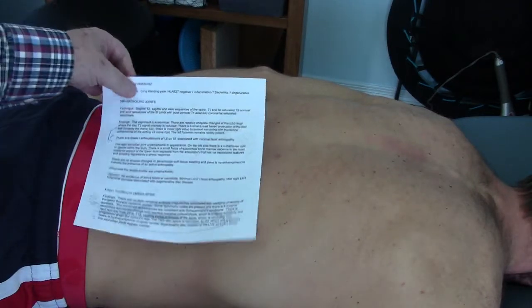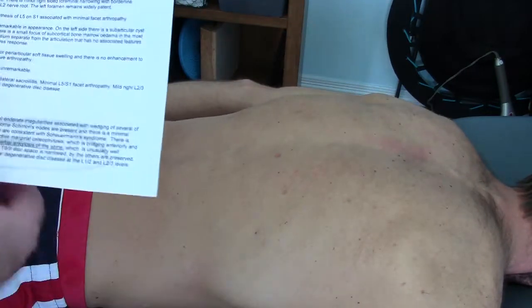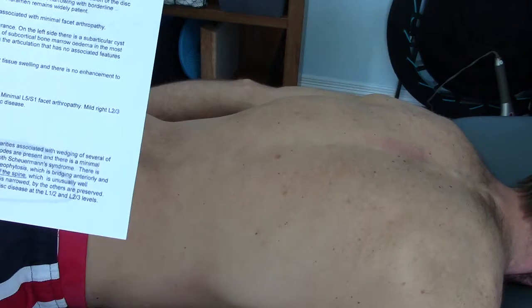This is Dr. Jerry Hesch, a physical therapist at Hesch Institute in Aurora, Colorado. And I'm reading part of the X-ray report on the thoracic spine. There are multiple vertebral end plate irregularities associated with wedging of several of the lower thoracic vertebral bodies.